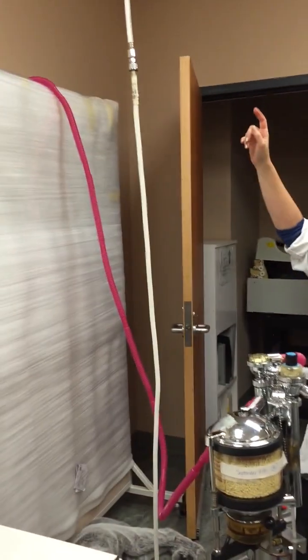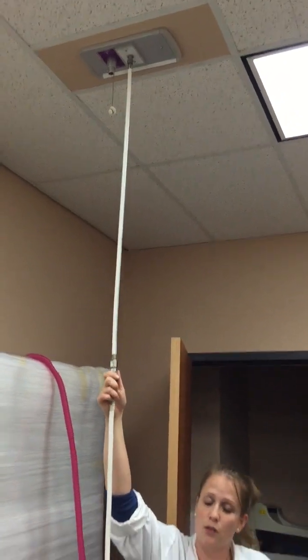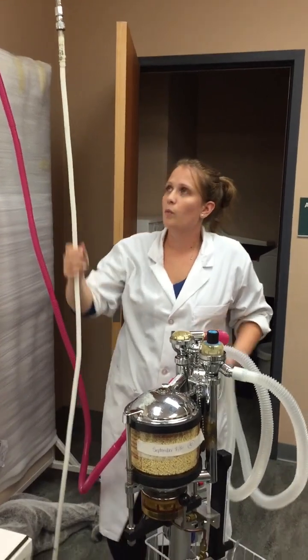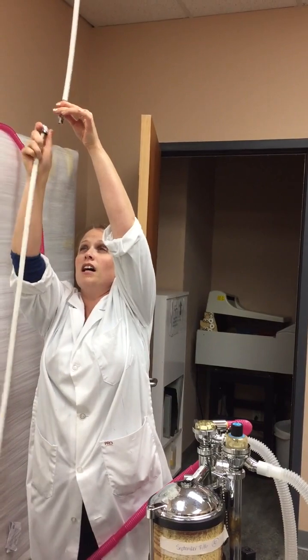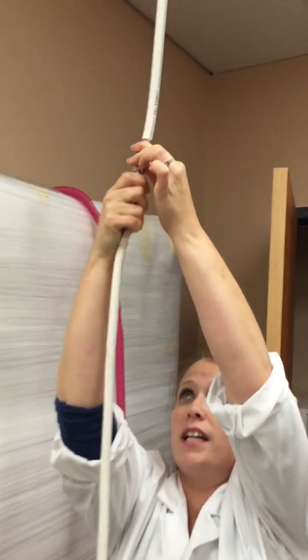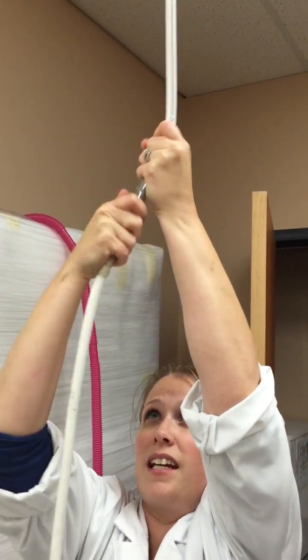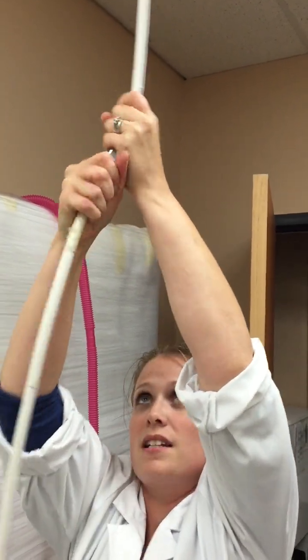From there, the oxygen will make its way to our oxygen drop lines in the ceilings, which we have multiple stations throughout the clinic that have these oxygen drop lines. We will connect the adapter from our machine by connecting it and turning it, and you'll hear as it's connecting, you'll hear the oxygen rushing in. When it stops and it's tight, you know you have a good seal.